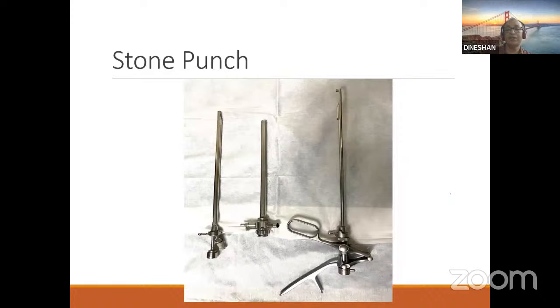And one more precaution is that you always close this handle so that the tip is always inside this, and it is released only when you are holding the stone. And once you hold the stone in this jaw, elevate the jaw from the bladder base and rotate the handle by 90 degrees so that you make sure that there is no mucosa you are holding in between. That is the only way you can reduce the bladder injury.